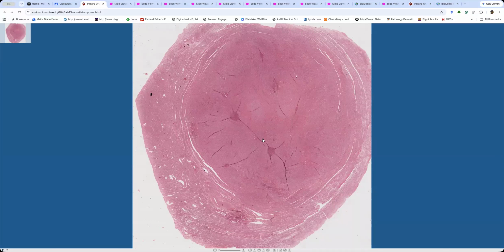So you can get ischemic necrosis in leiomyomas, but dear God, you can also get tumor type necrosis, okay, where it survives around the little vessels, right? Tumor type, it's outgrown its blood supply. Two kinds of necrosis. When they first started classifying this necrosis, they called the tumor type necrosis coagulative necrosis. So if you're reading old textbooks, don't get confused.